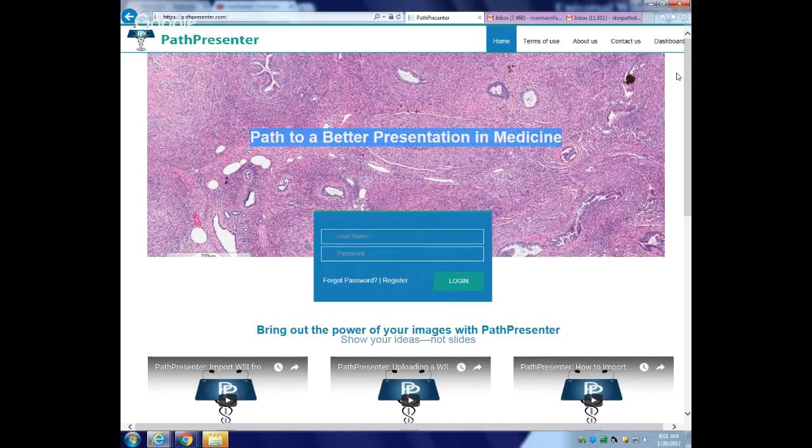Path Presenter is a platform that we have built for self-learning of pathology, for teaching of pathology, for making any presentations in pathology and sharing cases actually. These were problems that we always faced in pathology, and we tried to make a platform that could solve these problems. So how do you use it for self-learning?